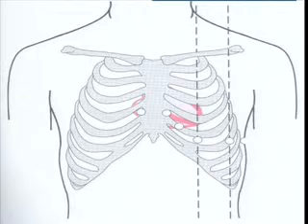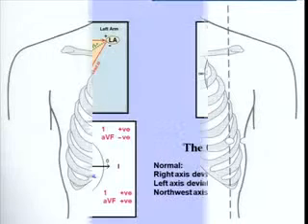These are the horizontal chest leads which have been connected. There is V1 to V6. V1 is present at the level of the 4th right intercostal space. V2 is at the same level in the 4th left intercostal space. V4 is in the mid clavicular line. V3 is between V2 and V4. V5 indicates the lead is present in the anterior axillary line, and V6 in the mid axillary line.